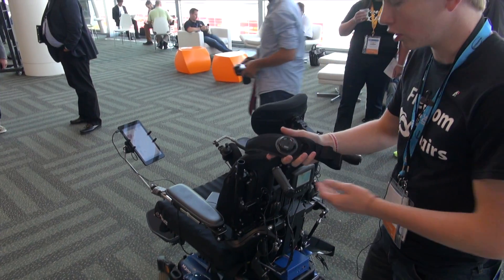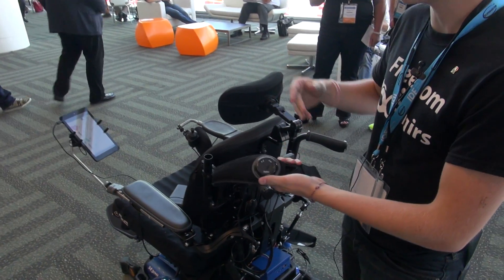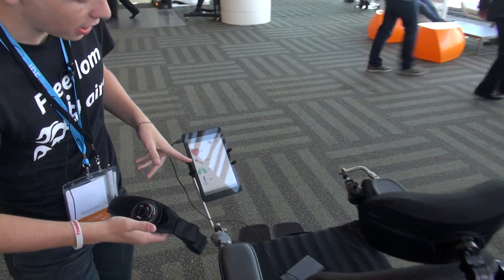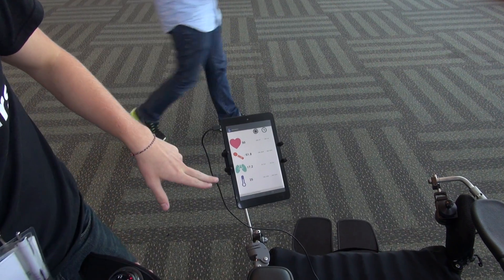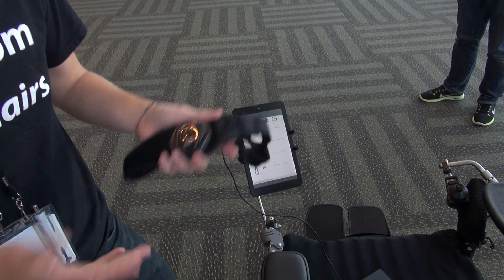Our second pillar was a biometric pillar. This is a bioharness, and it was used to actually collect data ranging from heart rate, posture, breathing rate, and the temperature of the person. The wheelchair user wears this underneath their clothes and it collects all those data points.